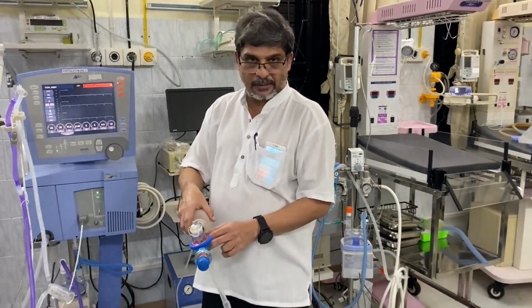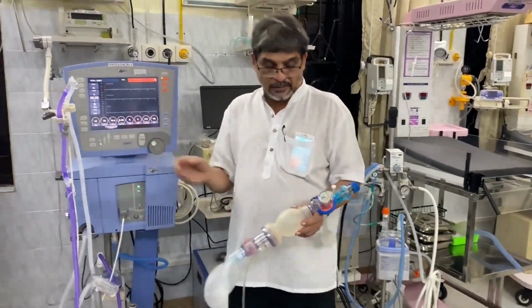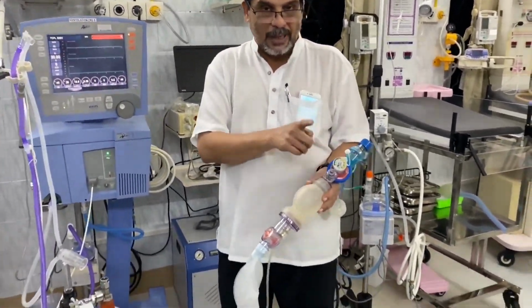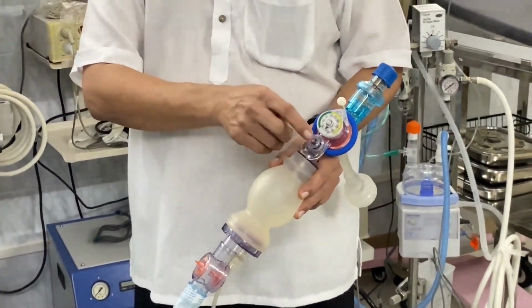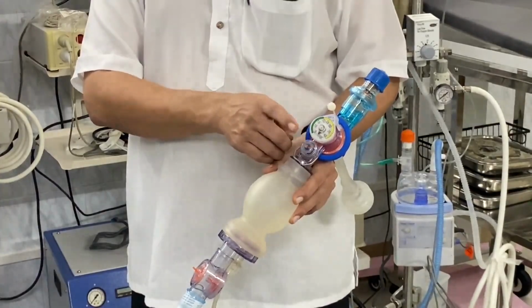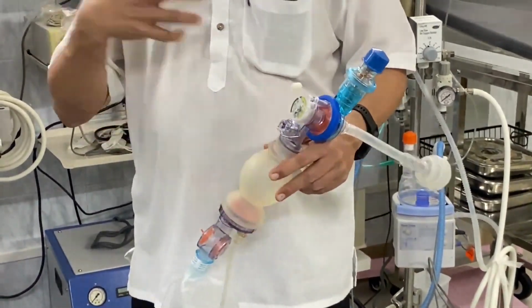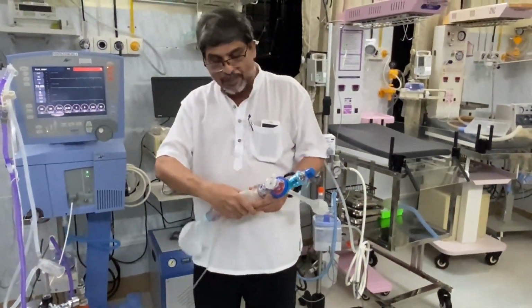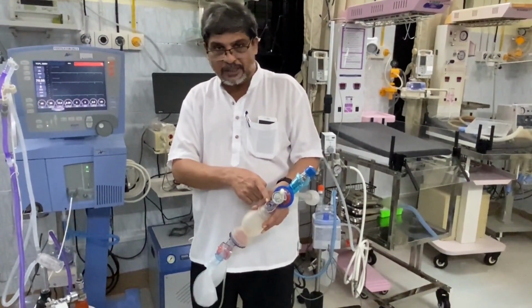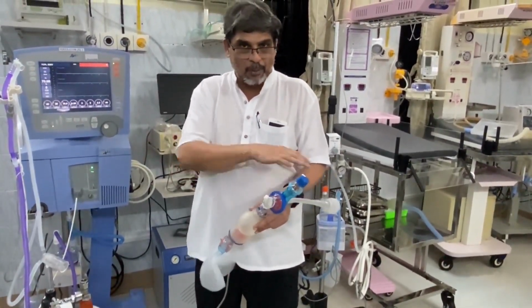positive end-expiratory pressure. Plus, you have something called safety features in the ventilators. So you can set your maximum pressure by this valve. This is known as the pressure valve. It limits the pressure. You cannot give 50 centimeters of water to the baby's lung. The lungs will burst. So as soon as you start pressing more, this is known as the pop-off release valve. It releases the extra pressure and protects the baby.